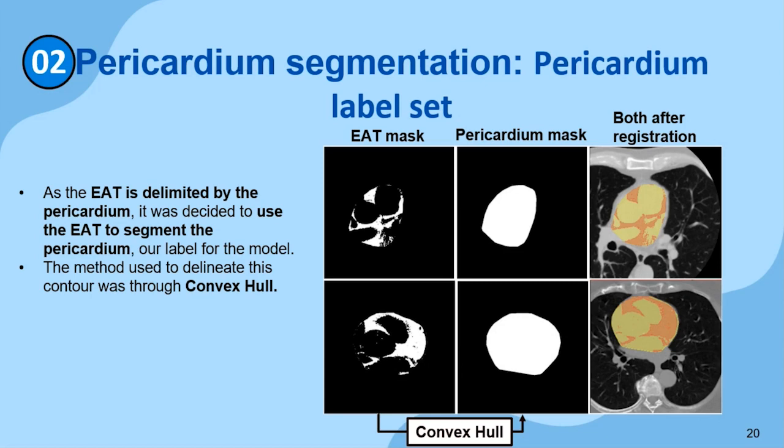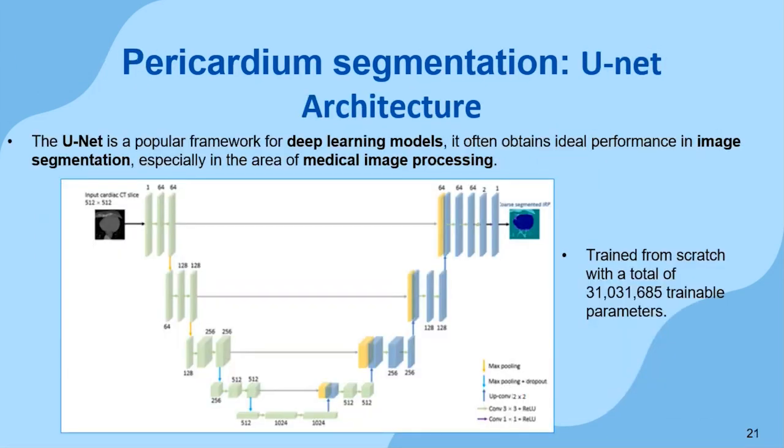Now that the labels are set, we use the UNet architecture for the model, which usually has good results for segmentation of biomedical images. It has a U-shape and consists of 2 essential parts: a contracting part that with successive convolutions will increase the number of features of the input image, and then an expansive part that will make successive transposed convolutions followed by concatenations in order to increase the image back to its initial size.